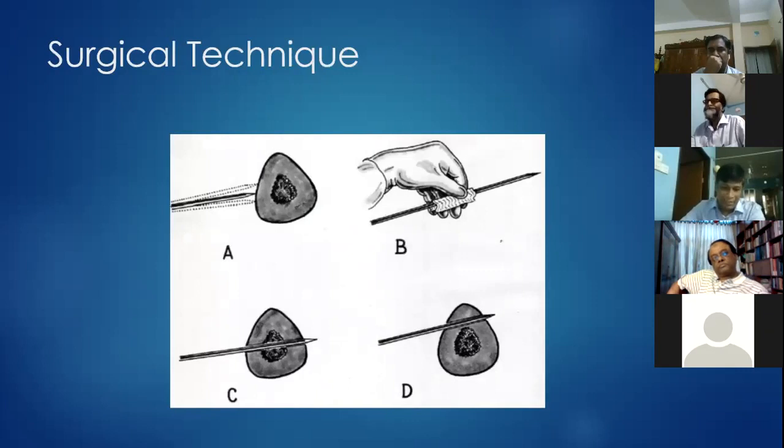The tip of the wire is introduced through the skin by simple puncture through the skin, fascia, muscle, and up to the bone, not by drilling, only puncturing manually. It is useful to slightly move the tip of the wire up and down transversely to the bone surface to ensure that the tip is not on the bone slope and will not slide down when drilling the wire through the cortex layer is begun.